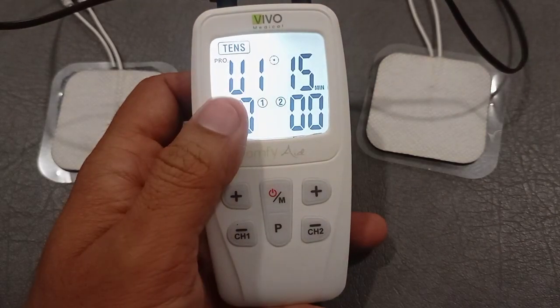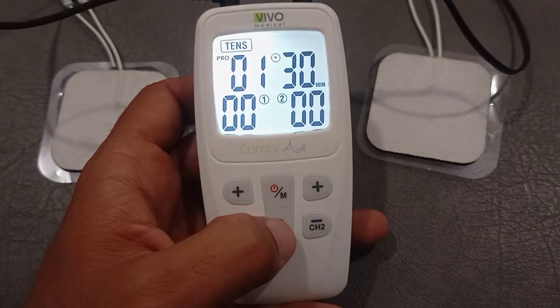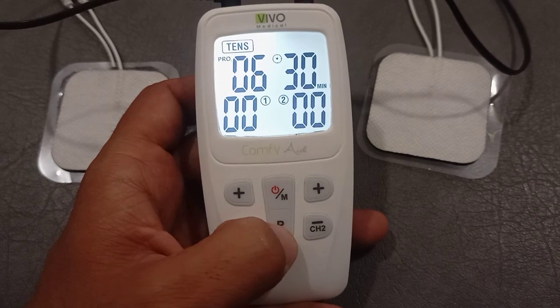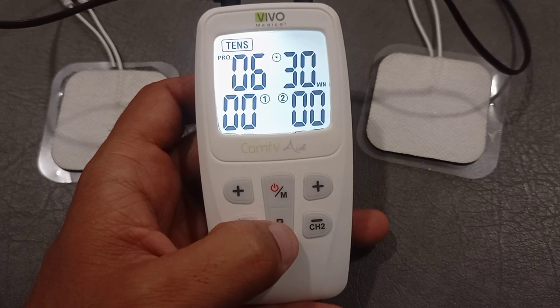But as soon as we see U1, it is user defined, and there are 3 protocols that a user can define. For programs 1, 2, 3, 4, 5 and 6, you can read the manual that comes with this device. I will be discussing how to customize these devices for your own patients or for yourself.